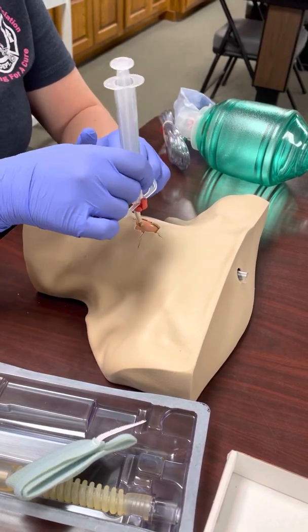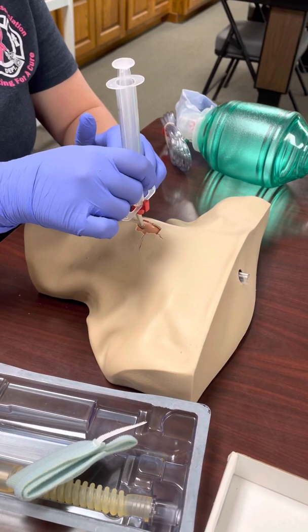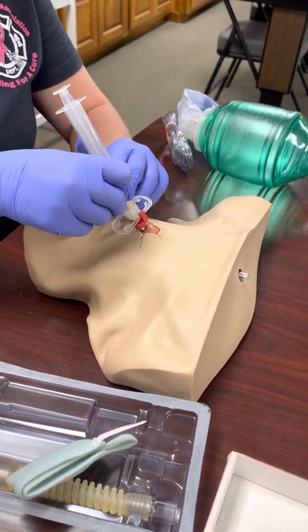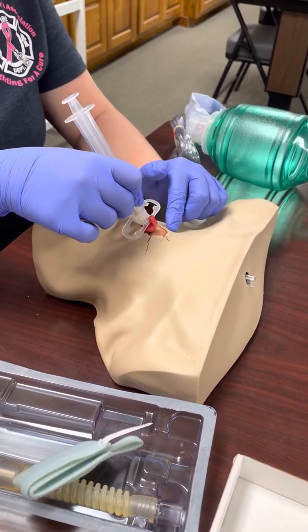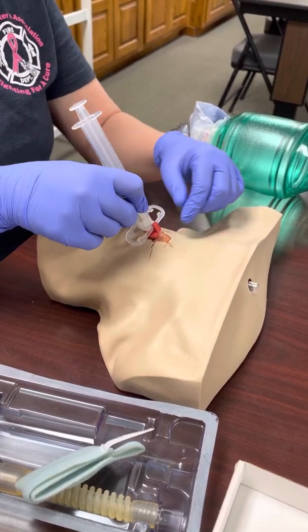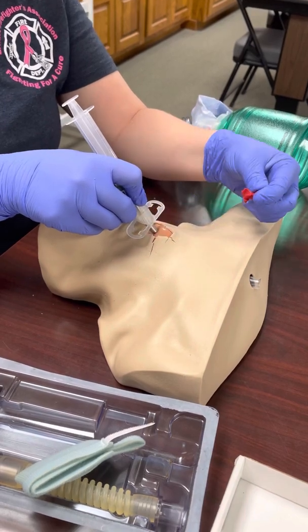To get this in, you want the bevel away from you. First, just poke through the skin and then puncture that membrane — you should feel a pop. As you can see, it naturally starts curving along the natural curve of the Quick Trach, which helps guide it through the trachea instead of going straight down into the esophagus. Push it down to the red stopper.